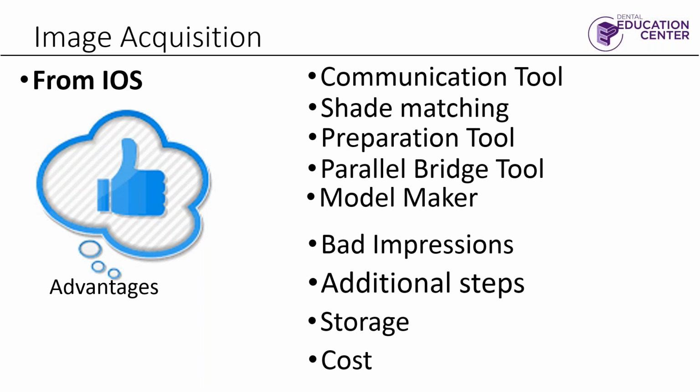And going back to that whole time is money thing, that's 50 minutes for every unit that I'm delivering. In that amount of time, I could have another patient seated and prep another crown. So the time saving of having restorations fit accurately, and not needing an exorbitant amount of adjustment, is extremely valuable.